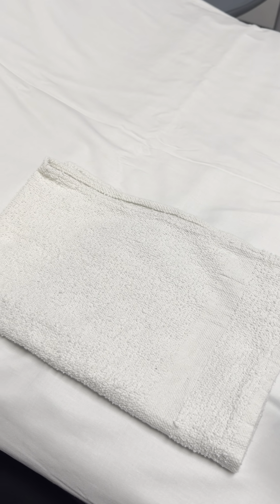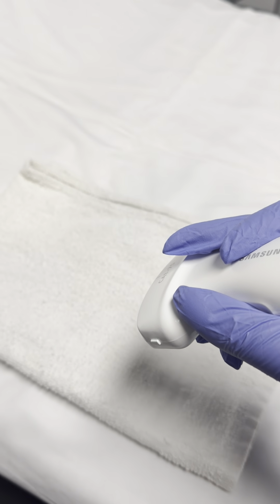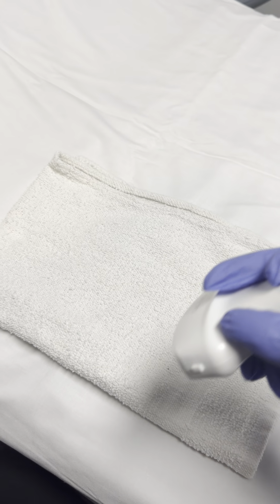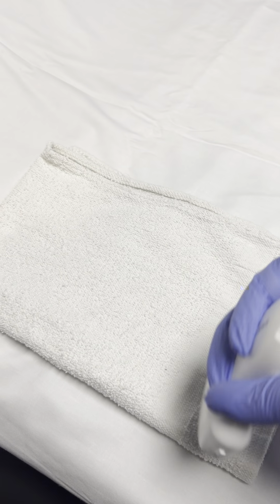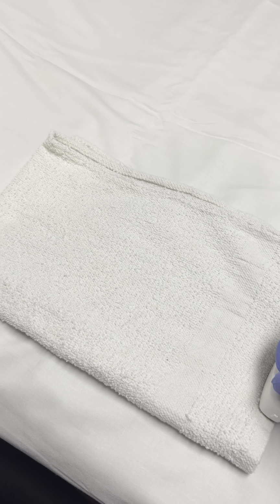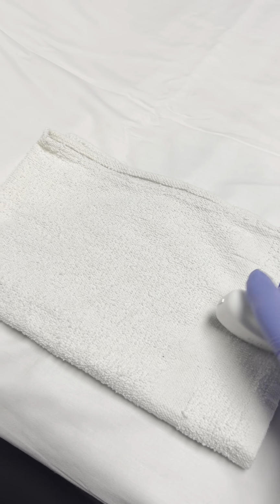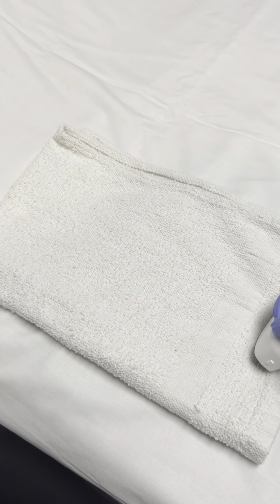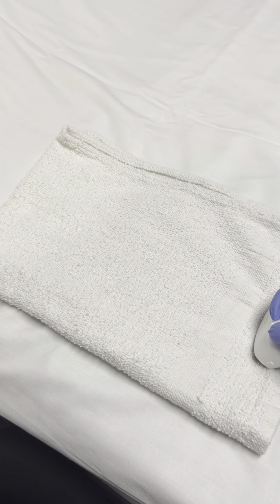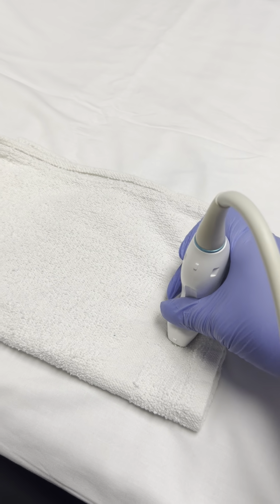First and foremost, I always say, okay, we're going to see what position the baby is in. There are different techniques for how you can do this. I'm in a transverse as I'm looking to see what position the head is in, and so I start transverse. I know some start sag, but I do start transverse. I locate the head. In this case, head is down. I show head is down, and I take a picture of that.